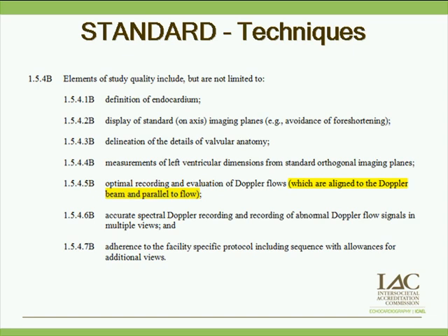And you have to adhere to the facility-specific protocol, including sequence, with allowances for additional views. So what this standard means is that basically everybody has to follow the same protocol. Now, we do certainly understand if you have pathology that you want to take additional views and document, or if you have a very technically difficult patient and some views just aren't available.